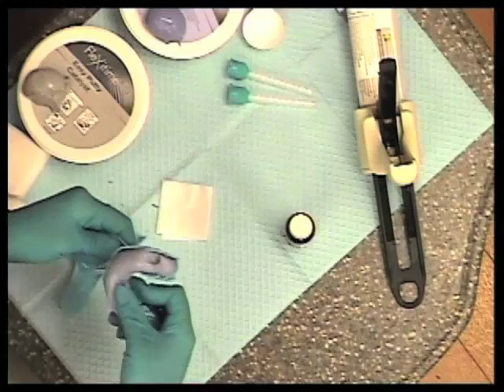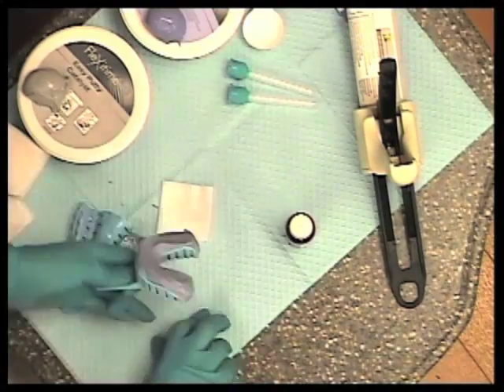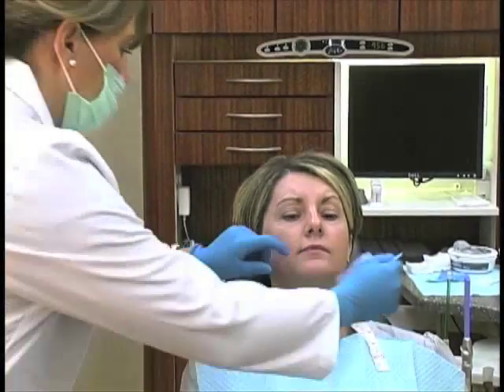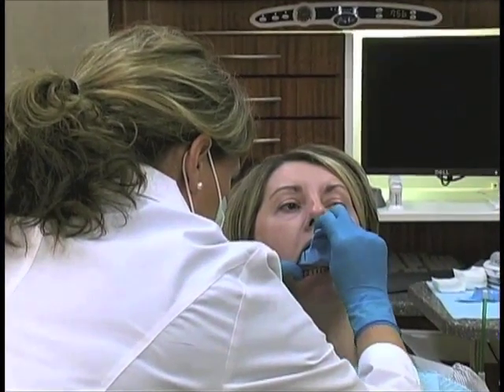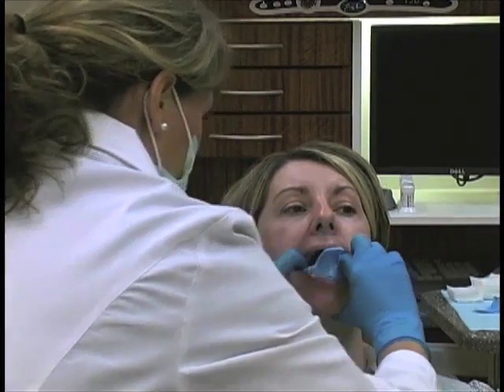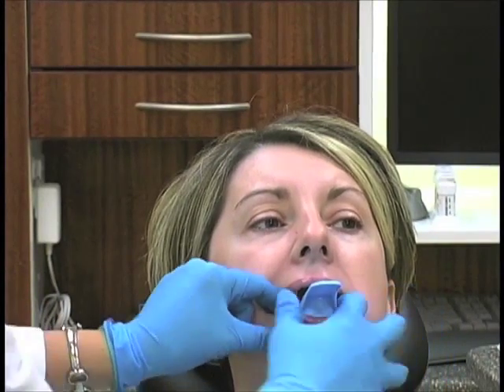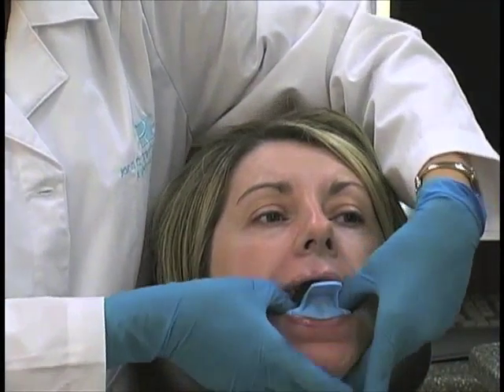Now we're going to be doing the mandibular cast, or the mandibular impression, first. And so now she can go ahead and come to the mouth with it. So again, what's interesting about this technique is our ability to go ahead and seat this. And we're going to wait maybe 10 or 15 seconds, but we don't let this material set up. If you will, we're creating a custom tray.